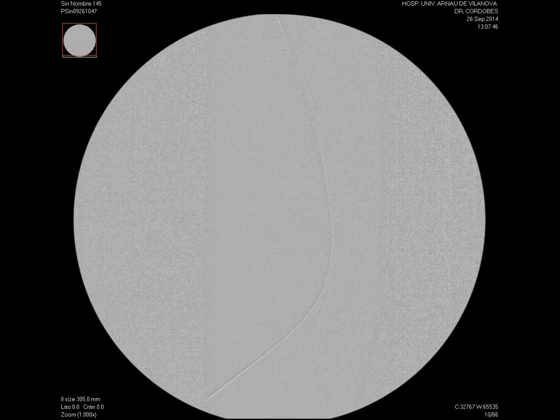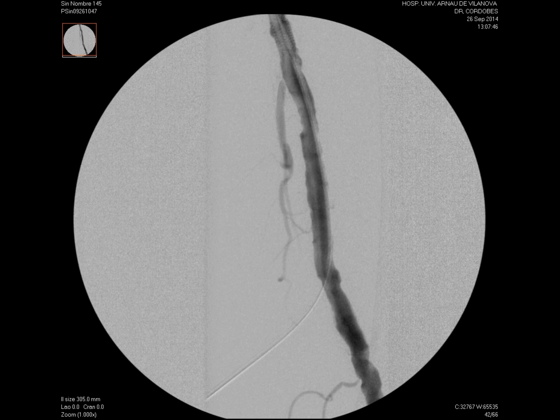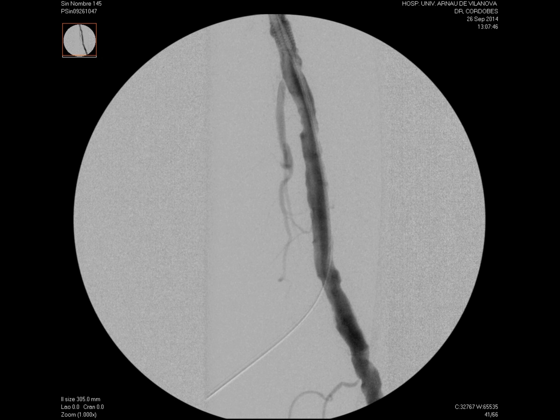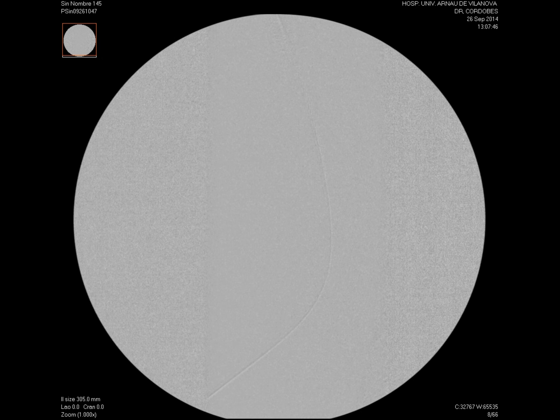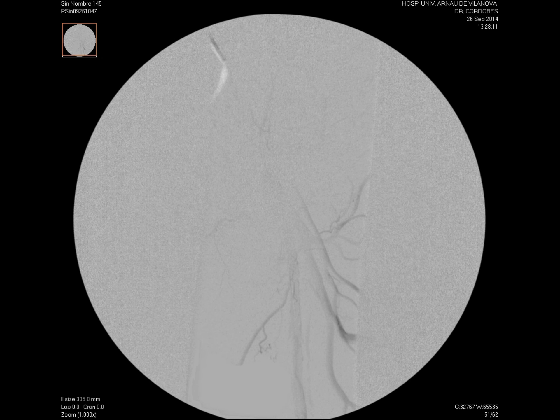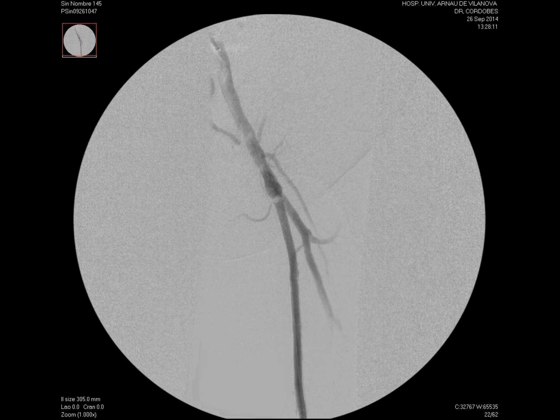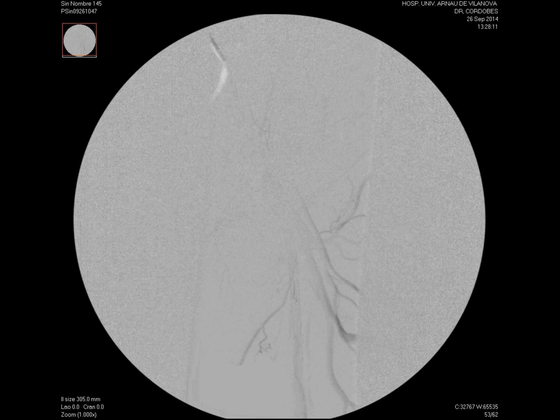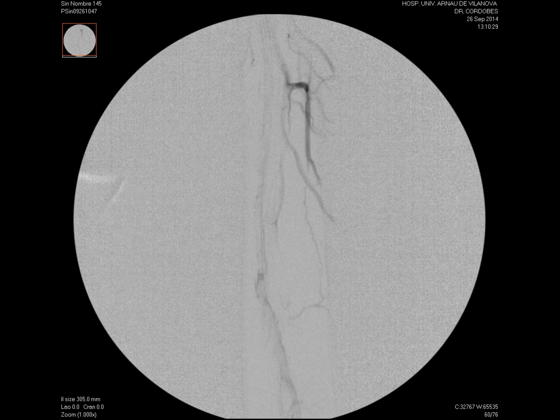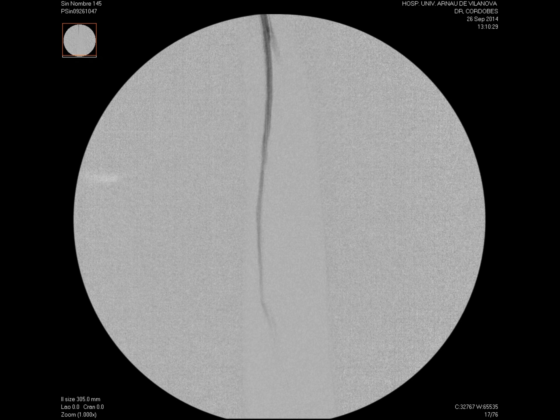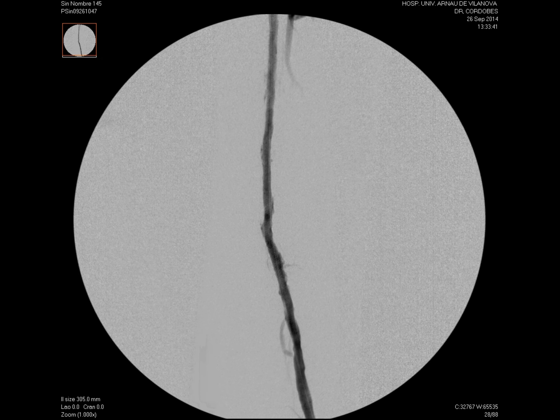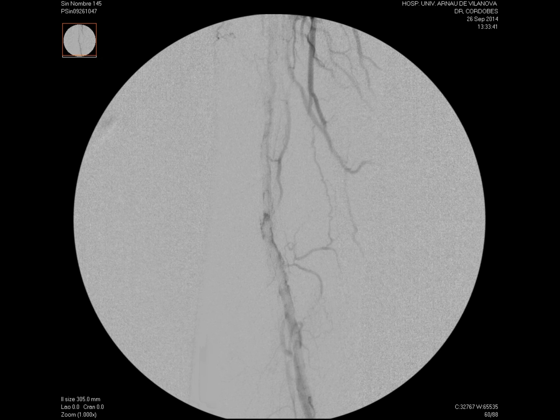Here we can see the angiographic control from the proximal sheath while we release the second stent, avoiding its exit through the retrograde approach. Here we can see the final result with perfect deployment of the stent at the origin of the SFA, and the total coverage of the occlusion. In this final angiography we can see that there are no complications at the distal puncture point after compression with an angioplasty balloon for 10 minutes.